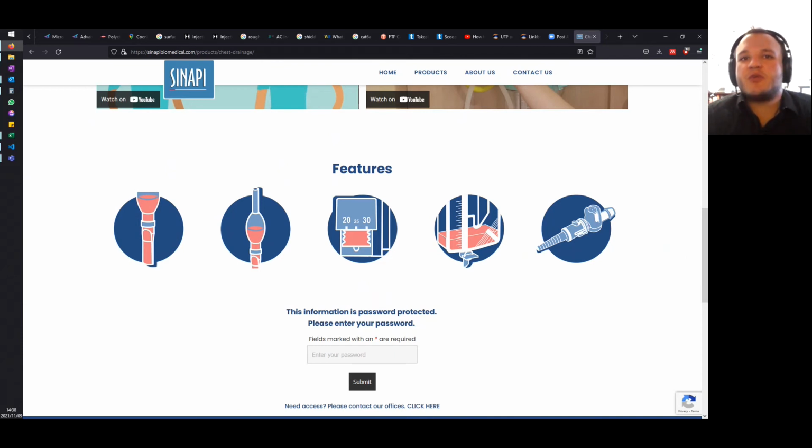Any issues that were brought up, ANSYS assisted us to show us how we could improve the simulation, or potentially what was being done incorrectly, so that we could get the correct results that we wanted.